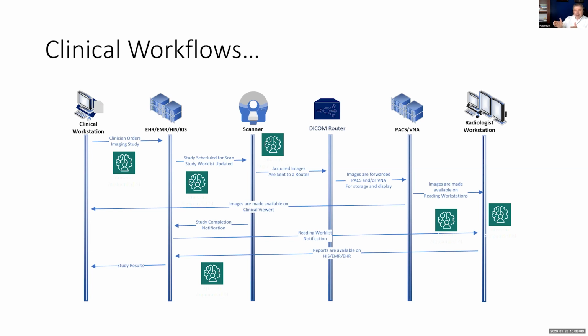So I just want to give a broader picture for awareness, because even though we're covering what we call pixel spaces, at the end of an algorithm, quite often your algorithm has to integrate with non-pixel spaces.